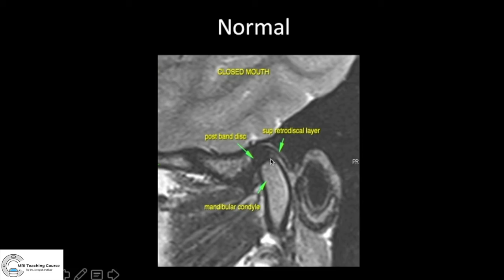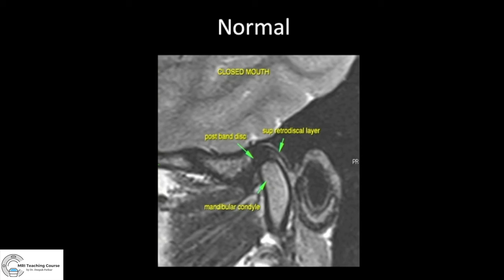How do we know if it's normal? The articular disc has an anterior band, a posterior band — both thick — and a thinner intermediate zone. Look at the junction between the posterior band and the bilaminar zone or retrodiscal layer. That junction should be at approximately the 12 o'clock position with respect to the mandibular condyle; up to 10 degrees on either side is fine. Some articles say up to 30 degrees is also normal, as patients can be asymptomatic even with the disc moved 30 degrees anteriorly. You can also clearly see the retrodiscal layer and the lateral pterygoid here.